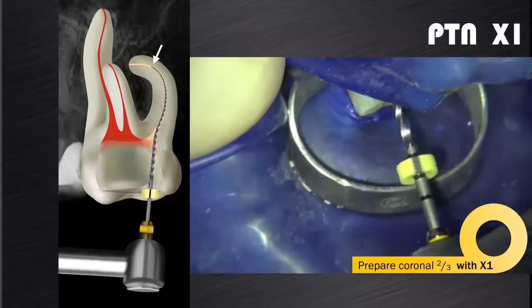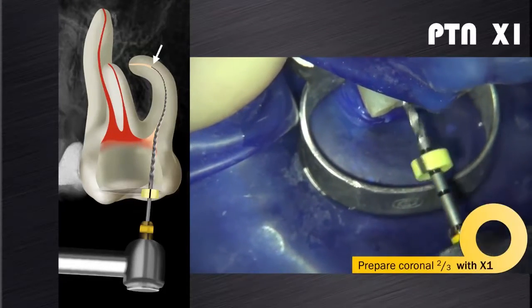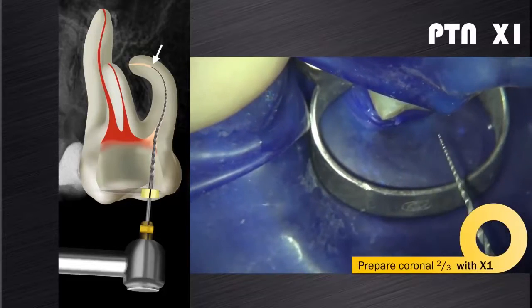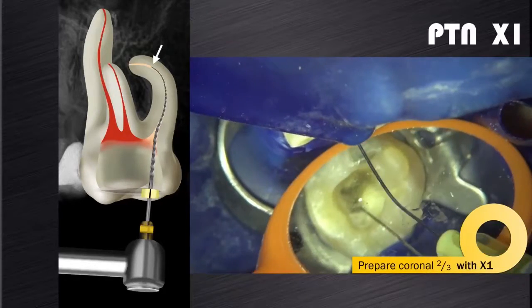On this video, you can see that I introduced the X1, brushed my way down for a few millimeters, but then experienced complete resistance, and I could feel that the instrument takes a lot of strain. In these situations, it is recommended to back out of the canal and follow with an irrigation cycle to remove debris and to check patency.